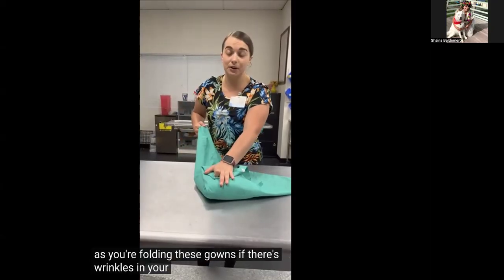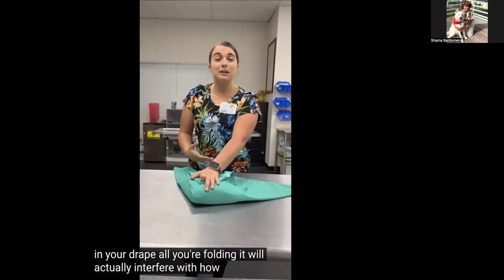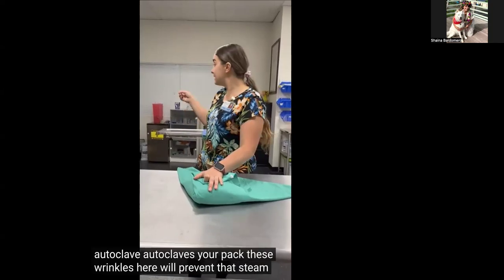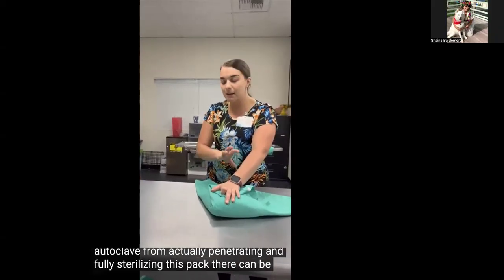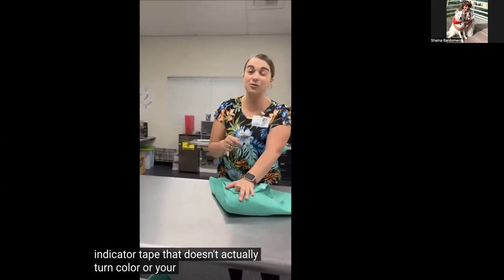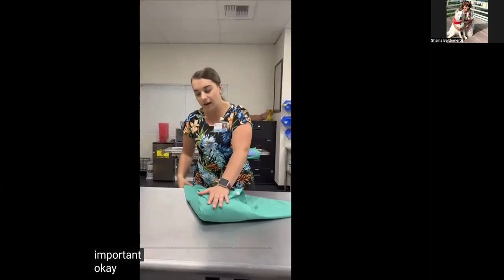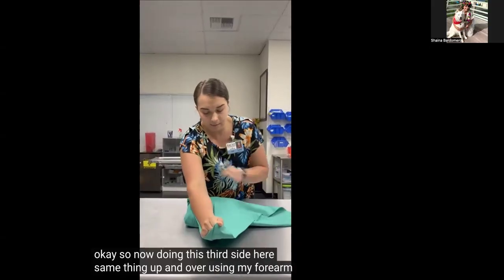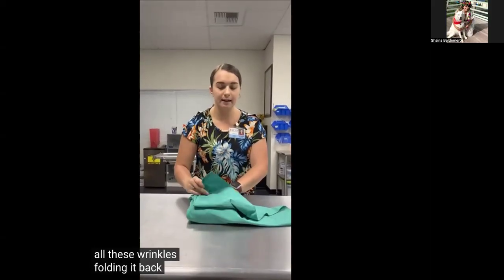If there's wrinkles in your wrap, in your drape while you're folding, it will interfere with how the steam autoclave autoclaves your pack. These wrinkles here will prevent the steam from actually penetrating and fully sterilizing this pack. This is when we can see the indicator tape that doesn't actually turn color, or your strip is kind of half turned color. So your wrapping is very important. Okay, so now doing this third side here, same thing, up and over using my forearm, then placing my hand on top, getting out all these wrinkles, folding it back, and making that tab.